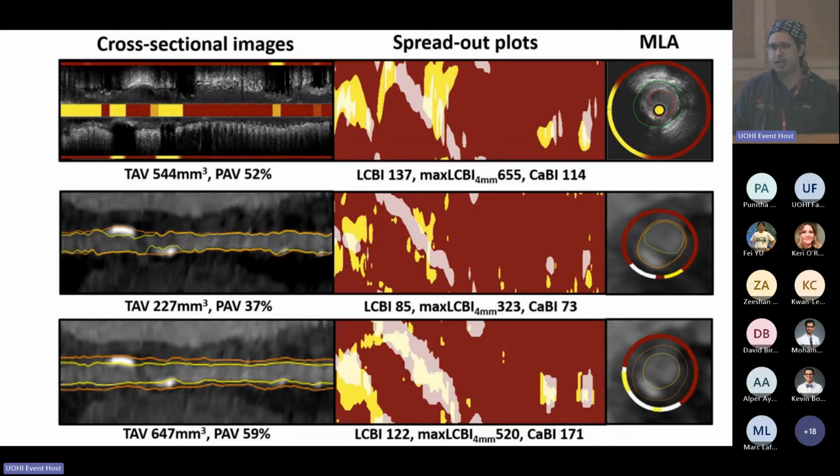These are experts who are on all of the boards we would recognize, names we would recognize from the top core labs in the world, and they cannot agree with each other looking at the same image on whether it's a vulnerable plaque or not. And those are experts who just do this for a living. They just look at vulnerable plaque on OCT. That's all they do. And their kappa is 0.22. That was in JACC Imaging in 2023. And that tells you that experts are not very good at it. That's why I think machine learning will have to come along just to reduce the inter-operator variability of how we're looking at these images, so there's something reproducible, because currently it's being done by humans and it's really not reproducible.